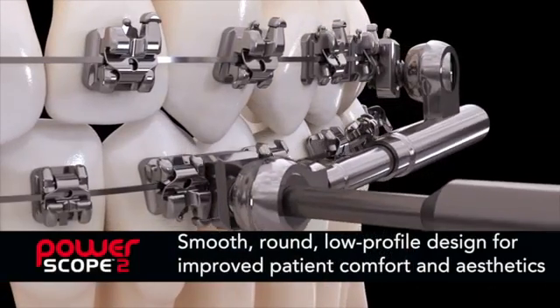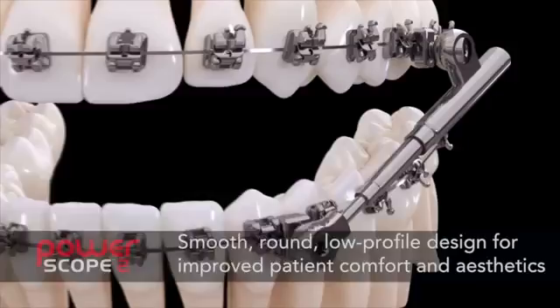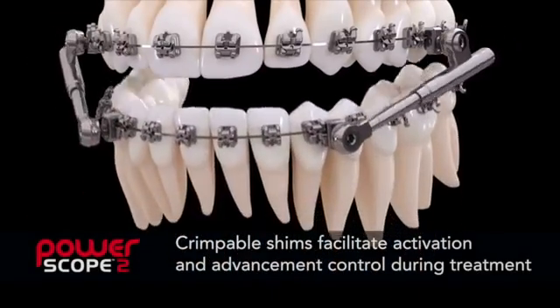Once installed, PowerScope's smooth, round, low-profile design helps improve patient comfort and aesthetics. Crimpable shims facilitate activation and advancement control during treatment.